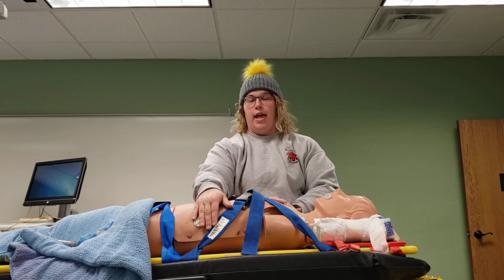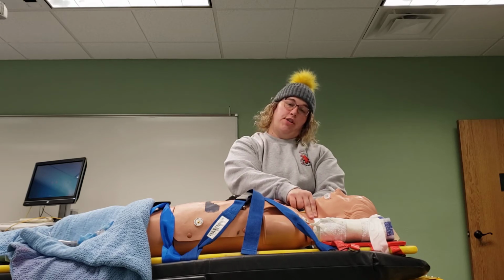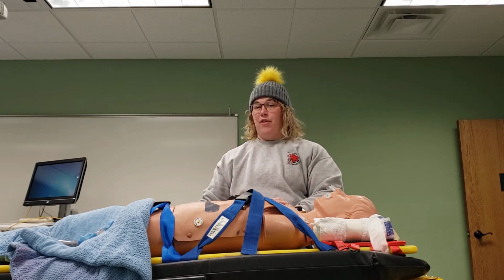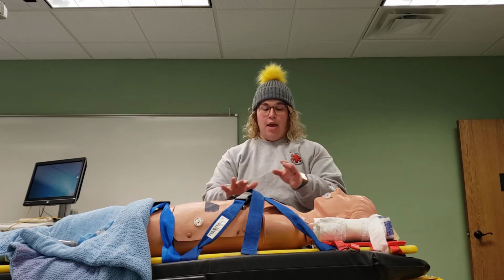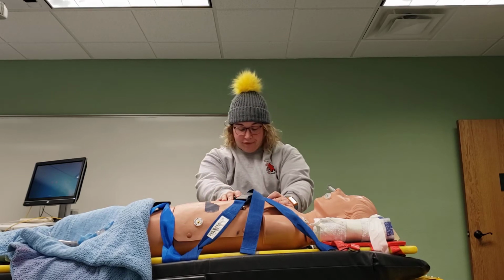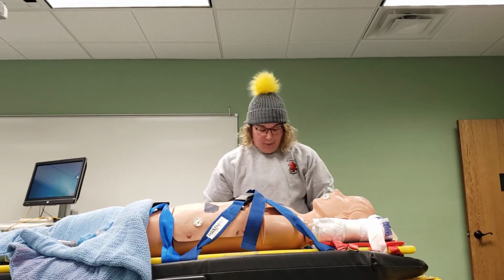We're letting the AED tell us when to pause. We're checking when that AED does tell us to pause to read that rhythm to see if they have a pulse. We're clearing the patient, all clear, before we push shock. And I'm sure you can pull up a video of the AED talking and you can practice with the actual AED. When you do National Registry, you'll have to do at least 2 minutes of compressions. So getting a little workout in, getting your body used to being over the patient and compressing. If that would fall and I'm alone, send help.